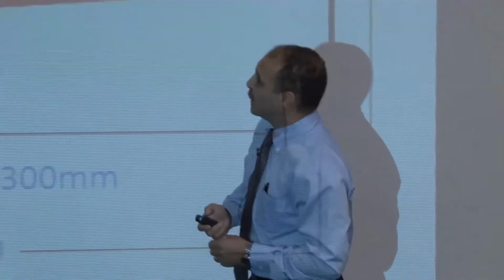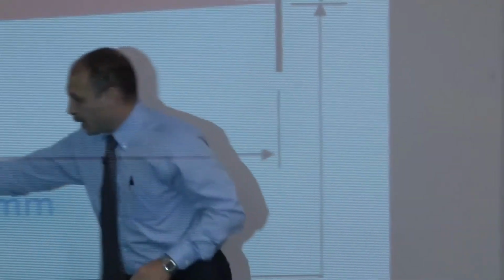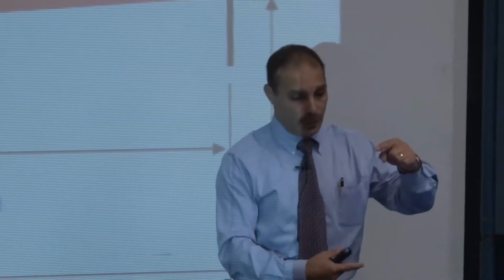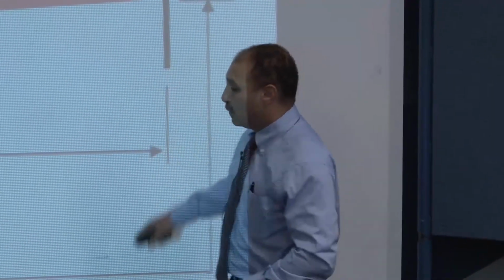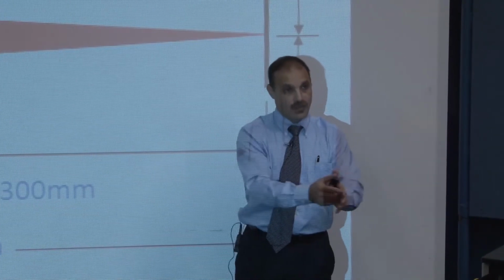Again, I promise this is the last, maybe there's one more science slide. It takes an objective and blows it out of proportion. On a normal objective, you have a working distance on a microscope of maybe a couple hundred microns. Half a millimeter, a third of a millimeter, maybe less. Our working distance can be anywhere from 3 to 30 millimeters, to 300 millimeters, from 3 millimeters to a foot, the working distance between the nose of the optics and the specimen. The field of view can be up to 10 centimeters. We can actually image stuff at microscopy level that's 10 centimeters wide.